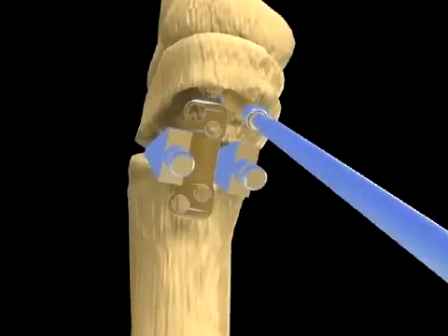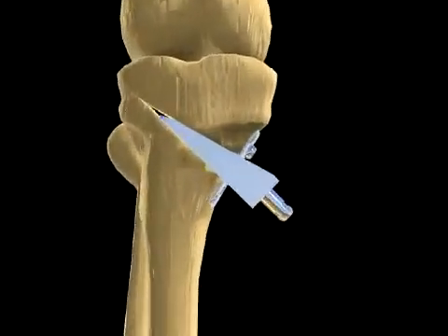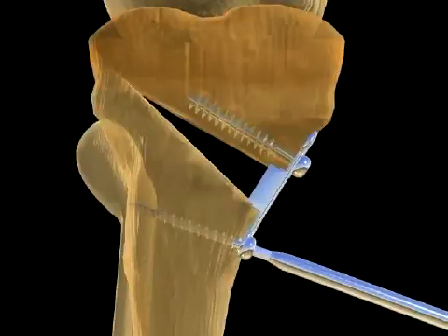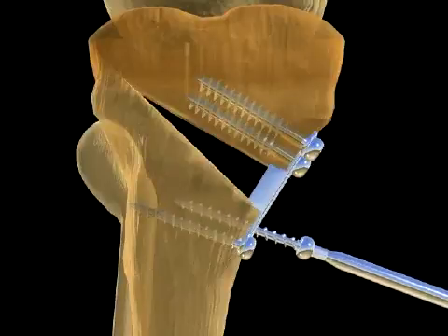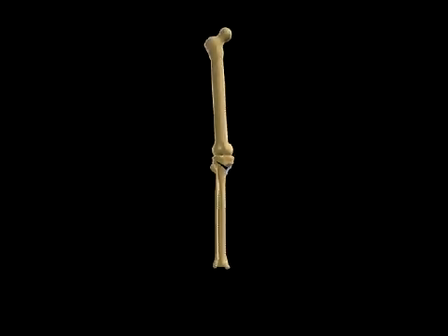Tricortical wedges of autologous bone harvested from the iliac crest are used as grafts in osteotomies greater than 7.5 millimeters. Following plate fixation and bone graft placement, the wound is irrigated and closed over a drain in the routine fashion. A sterile dressing is applied and the knee is placed in a post-op hinged brace.